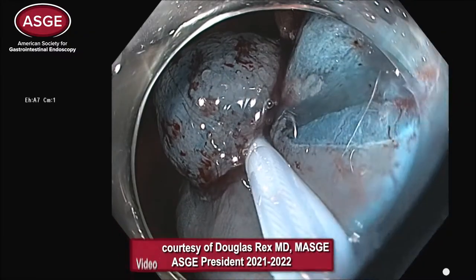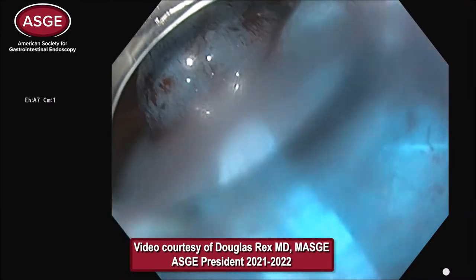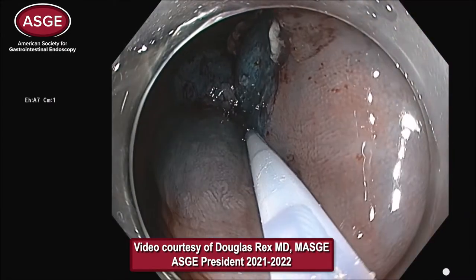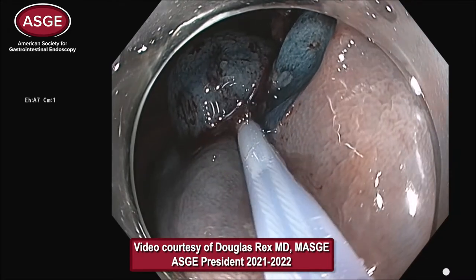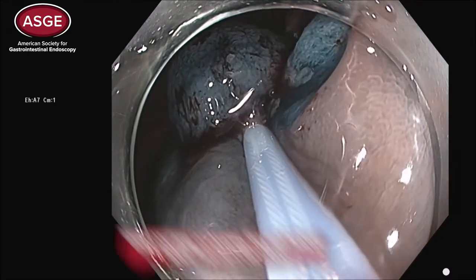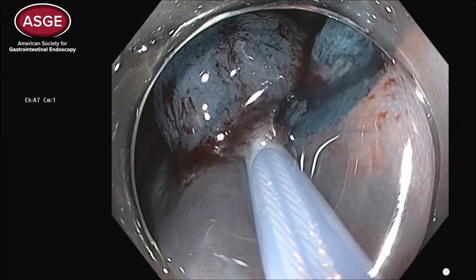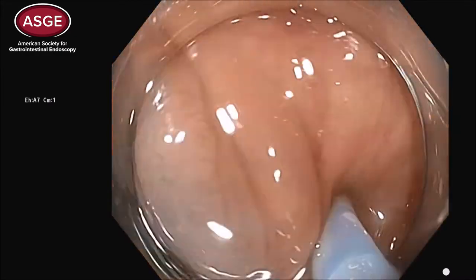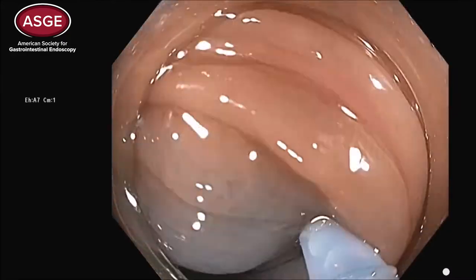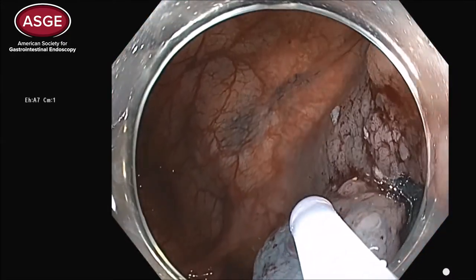We're watching an endoscopic mucosal resection of a lateral spreading lesion in the ascending colon. We've grabbed a hold of a piece of that lesion, opened the snare to release it, and now we're re-grasping the lesion and preparing for a transection. You can see off to the right the contrast stain submucosa from resection of a previous portion.